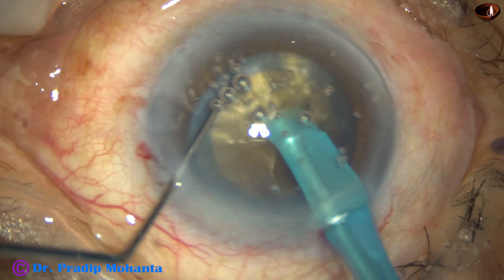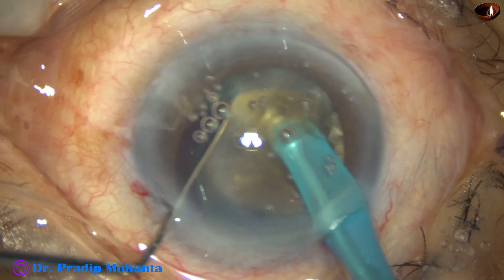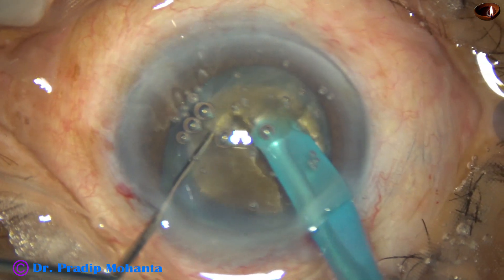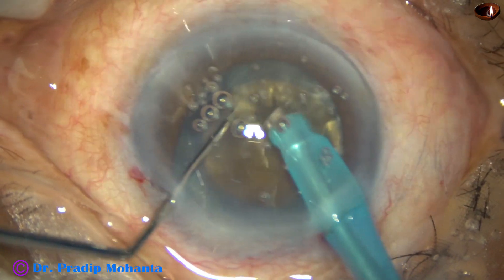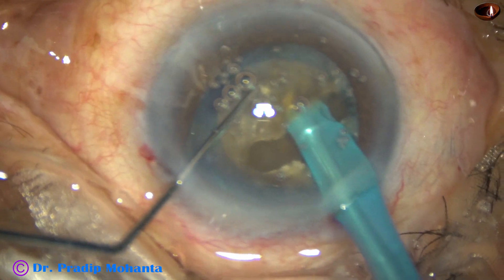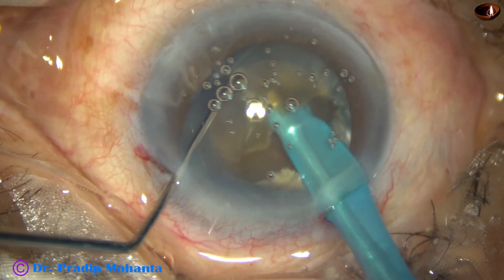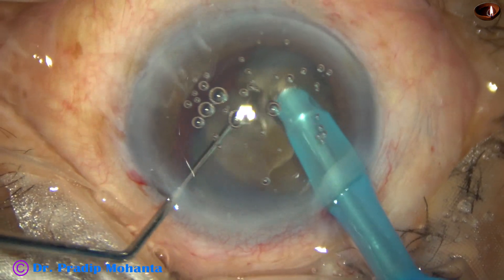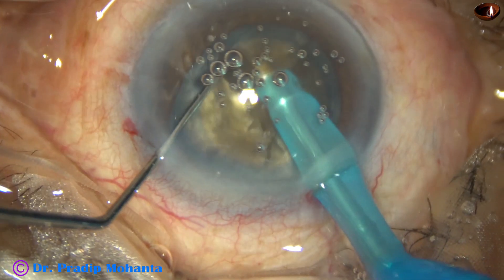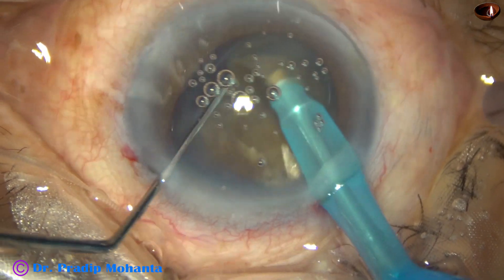Turn, go through the substance through another place, and try to make a crack — this is a very small crack. Turn the nucleus, hold it very firmly and try to crack. This time I get a good crack. Hold it here again, and here also I got a small crack.